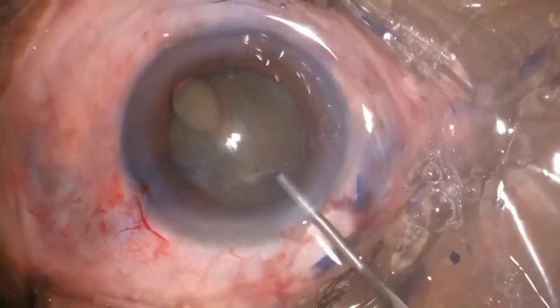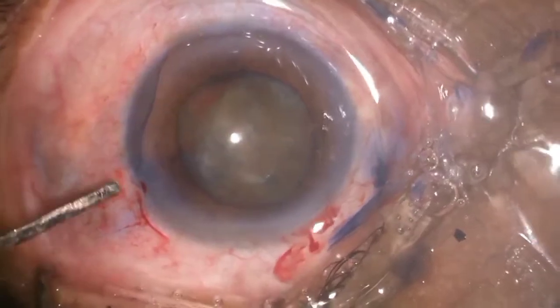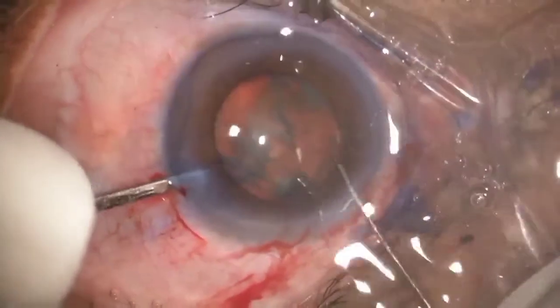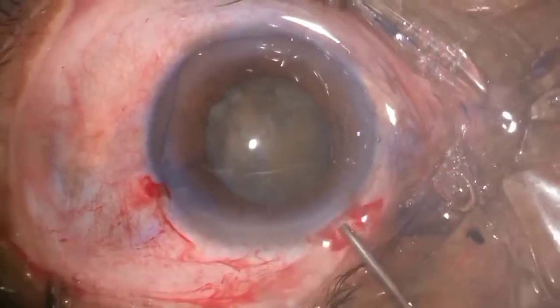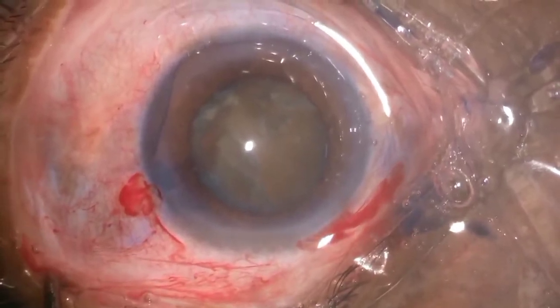After again forming the anterior chamber with viscoelastic substance, I decided to rotate the nucleus with the dialer, and it was rotating fine. That surely signifies that the hydrodissection was good. And now it came to the phacoemulsification.